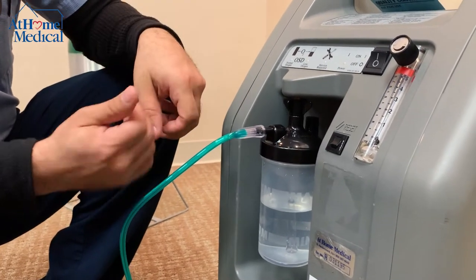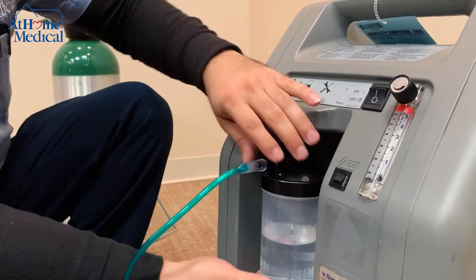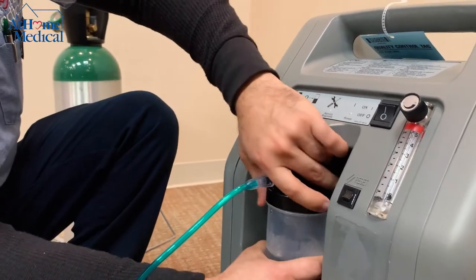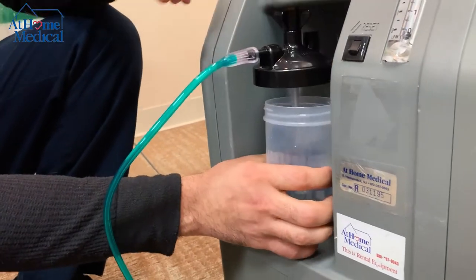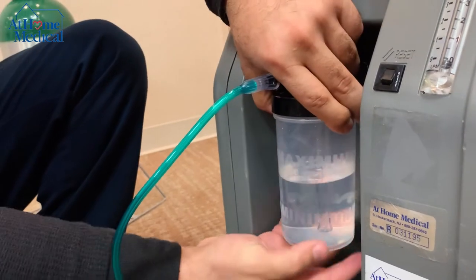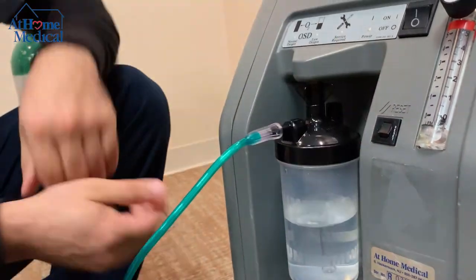Unscrew it and make sure it goes on easily. The same thing goes for the bottle itself onto the cap — always make sure it goes on nice, easy, and tight.